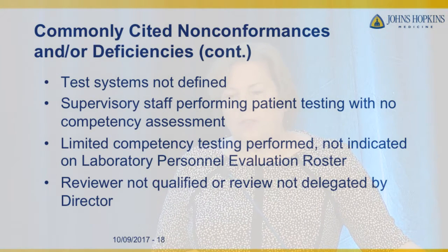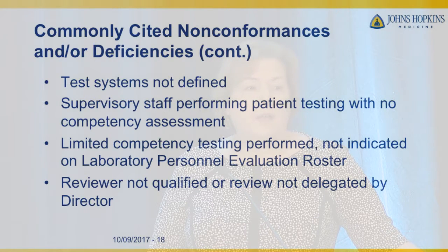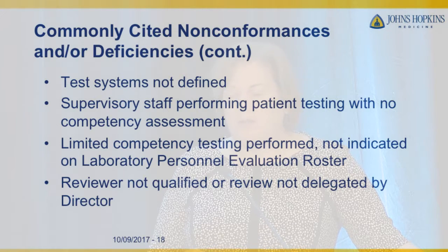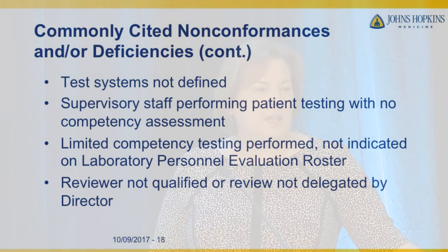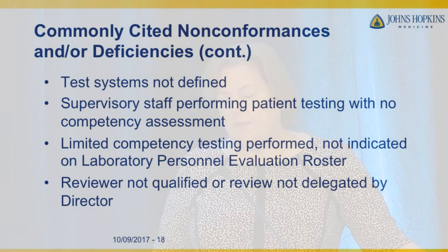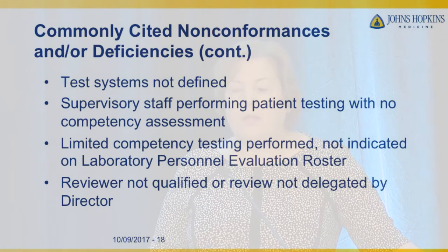And the next one is supervisory staff who perform patient testing, and I know that applies to a lot of us, including myself. We're all required sometimes to pitch in on the bench, but don't forget that if we're functioning as a testing person, or part of the personnel, our competency has to be assessed on the testing part just like everyone else's.